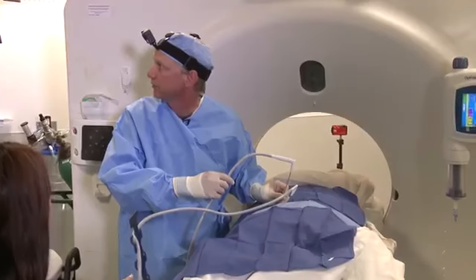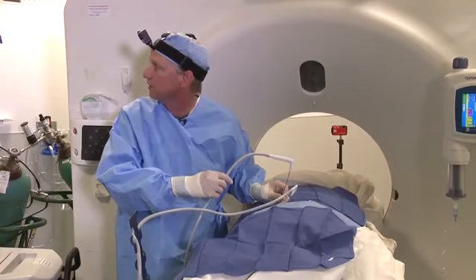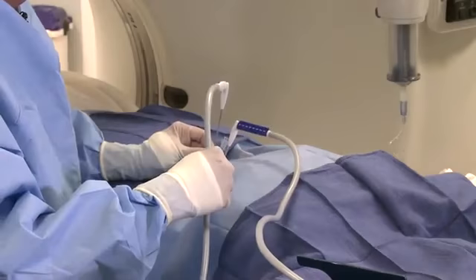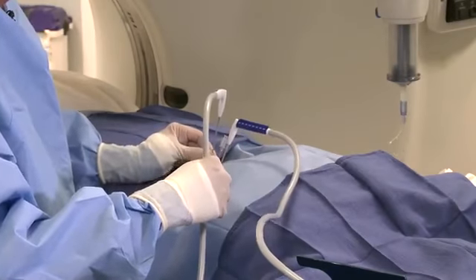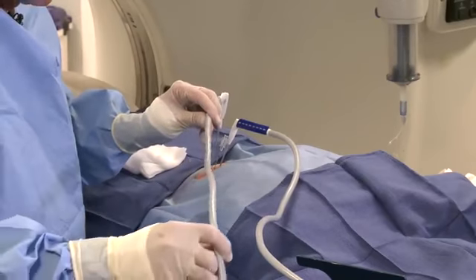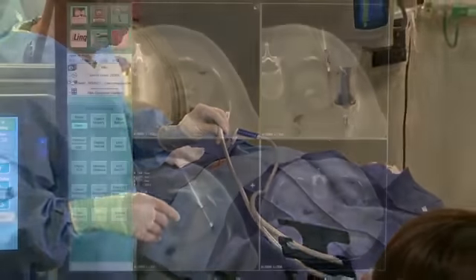So I'm looking back at the reference screen. I think this probe needs to be a little steeper than the guide needle was. So I'll advance it in. And again, fully expecting to have to readjust this. And we'll take advantage of this wonderful little holder over here.